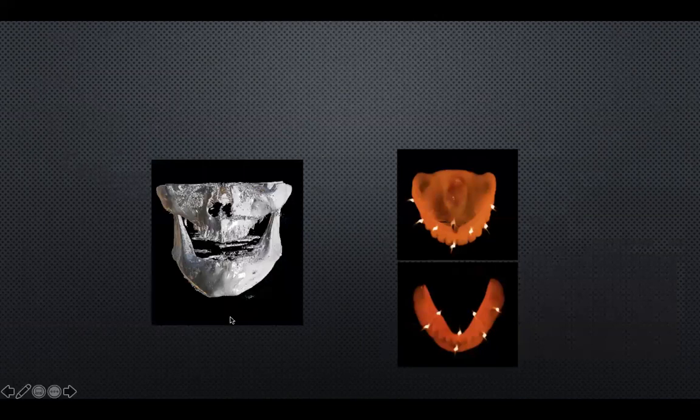One is the CT scan for the patient with the denture in place using settings for bone, and another CT scan for the denture, specifically with the different settings. And the metal markings here and here are not very recognizable in this photo, but we can easily recognize them here in this other scan.